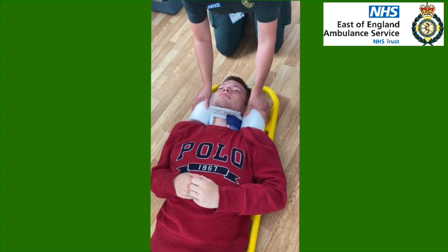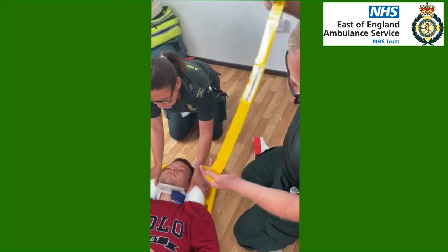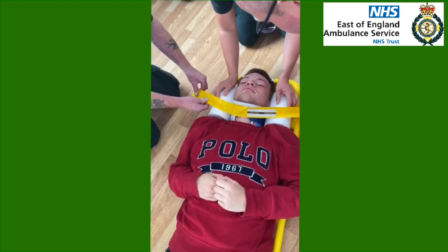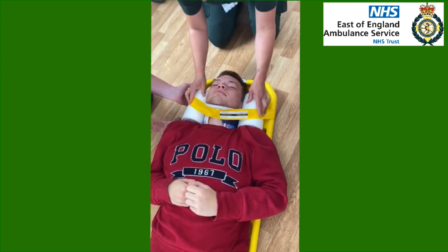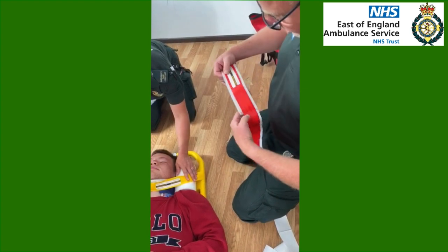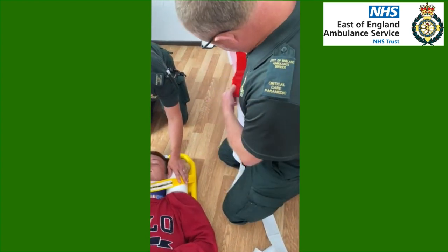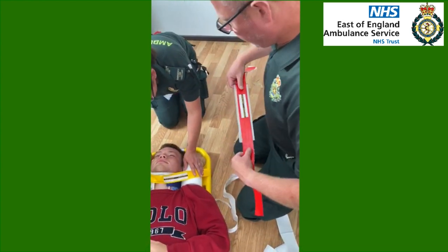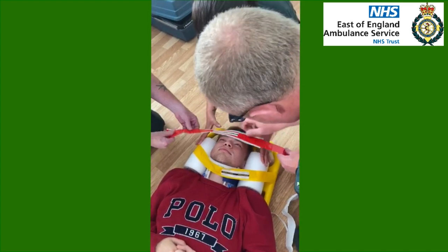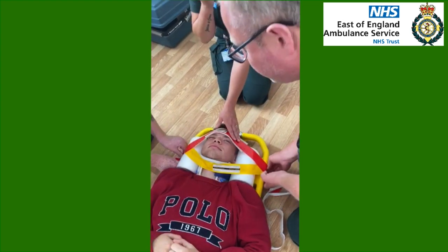We're going to go for the chin strap first. We take the sticky off the back and we put the chin strap on — it goes across there underneath the chin and up onto the scoop. Brilliant. Followed by the head strap. The only difference with the head strap compared to the chin strap is we take that off from there. The head strap goes across the top — this bit is not sticky so it doesn't affect the patient's head — and it goes down. Just hold it in position. So that is the head secure.